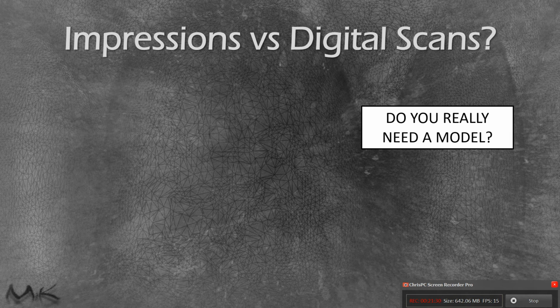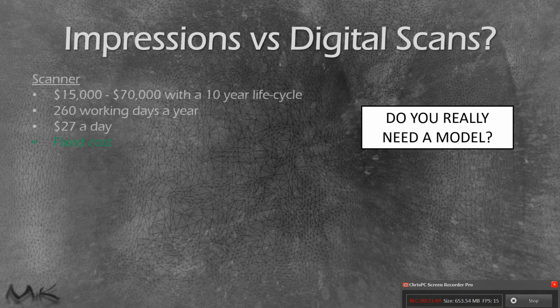I think of all the times that I poured up dental models as study casts, looked at them, especially when I was getting started in CAD/CAM dentistry. I'd actually make a provisional matrix just in case my CAD/CAM machine broke down, and then I'd never end up using that alginate impression. So I wasted all of that money and had to dispose of that stone model.